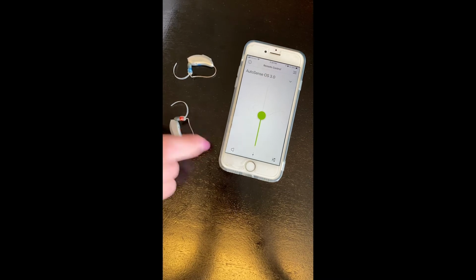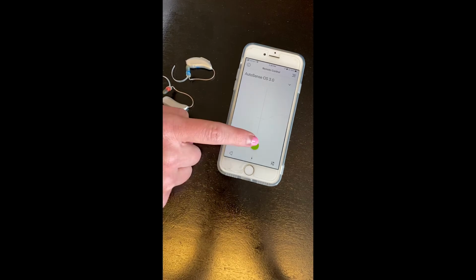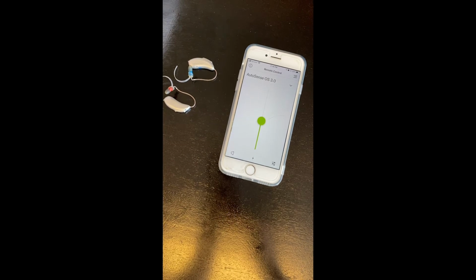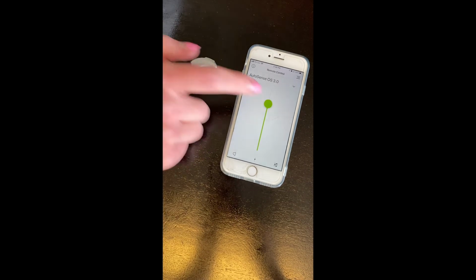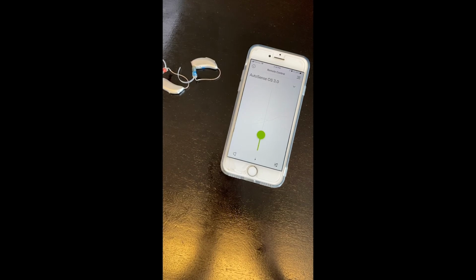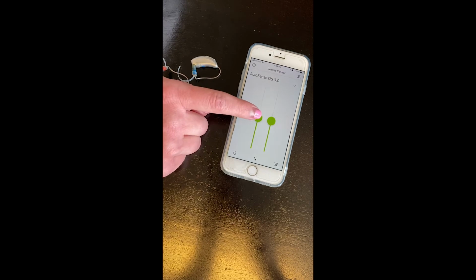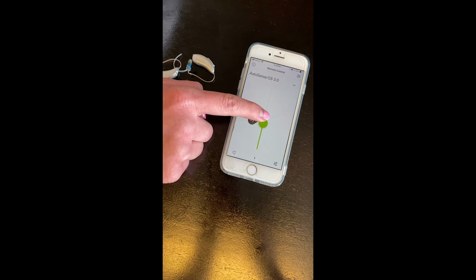And now we're at a screen where we can turn up the hearing aid volume and we can turn down the hearing aid volume. This right here, when it's at 0, means that it's at your neutral volume that you want it at most of the time. Any positive number is going to mean that you turned it up, and any negative number means you lowered the volume. You could always mute the volume, which means that there isn't going to be any sound coming out, and then you can unmute it by pressing that button. You could always split them up so you can turn up the left volume and the right volume, or you can just have them together, which I would recommend doing.